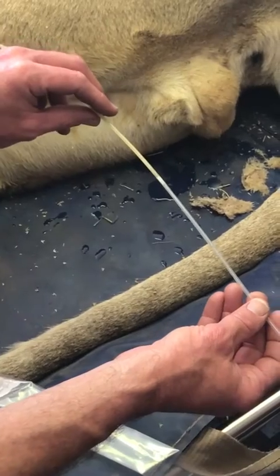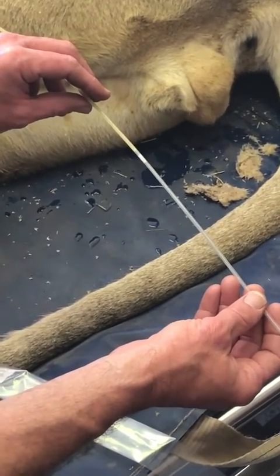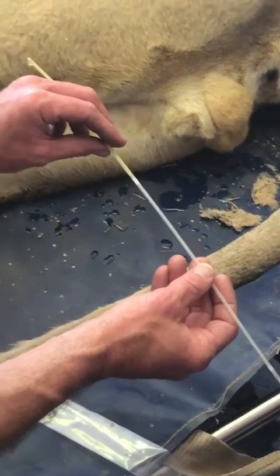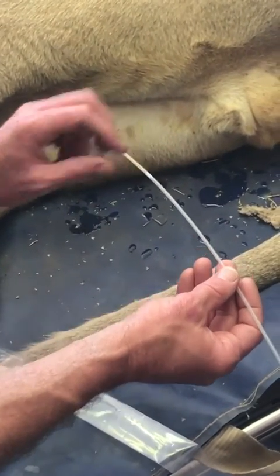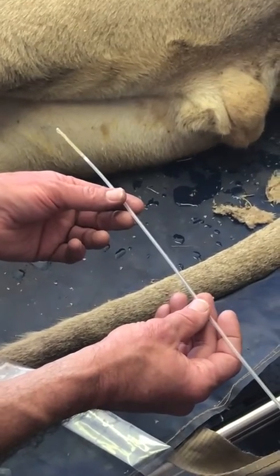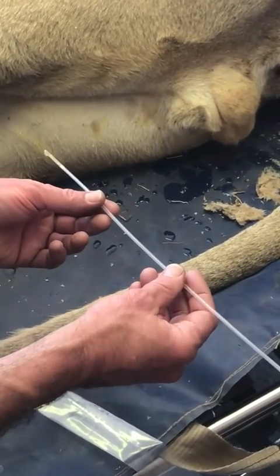We've got some good semen actually out of this guy. He's a bit younger, so that's why it's probably a little bit shorter than 18 cm. I don't try and do this — I'm supposed to run forward — and we'll stop there. You can still do morphology on the semen, it's just not a good quality now.